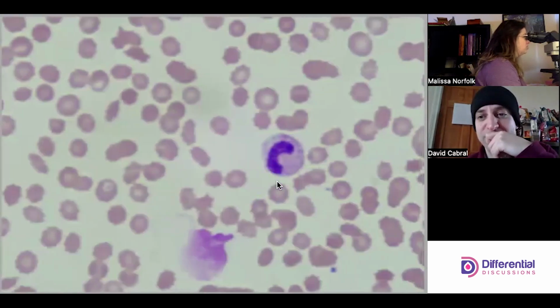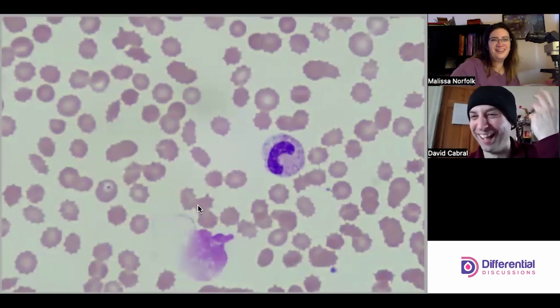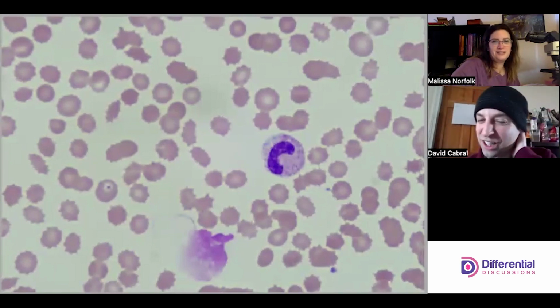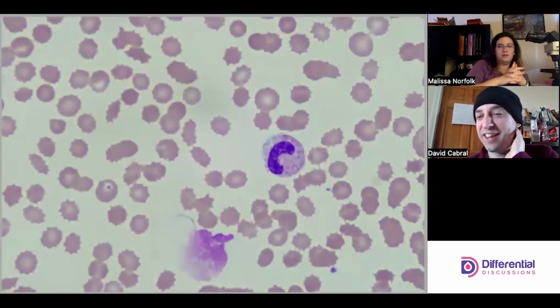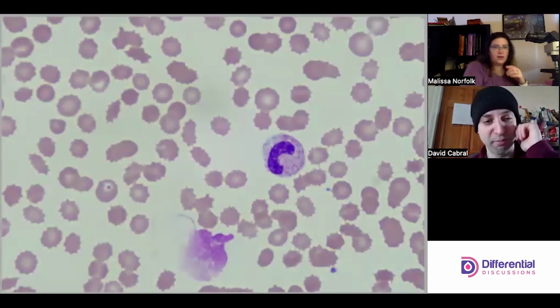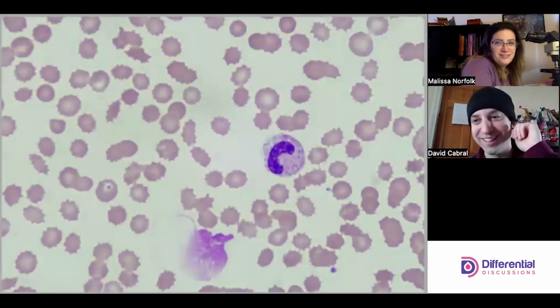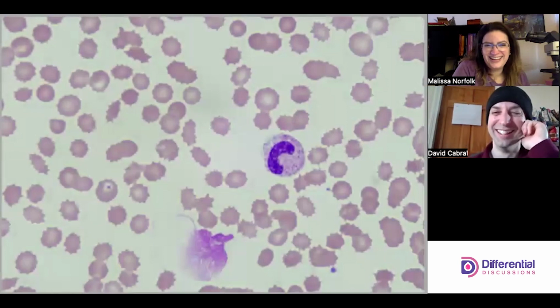Oh my gosh, look. What? The elusive band. Actually, one of my, it's not a bad example. No, it isn't. And this might be worth the click of a picture maybe. But yeah, I already did. What's that? I already did. Yeah. It's always way ahead of me.